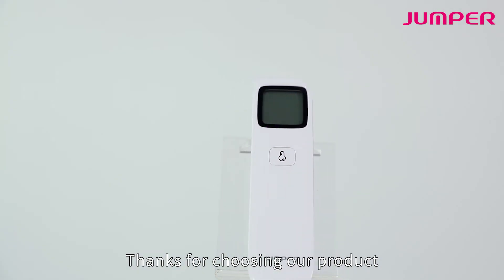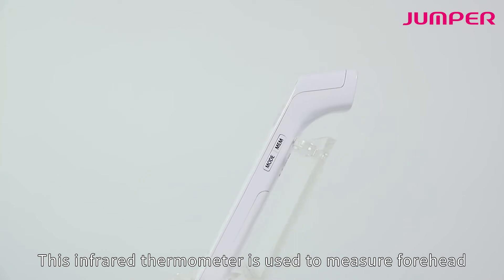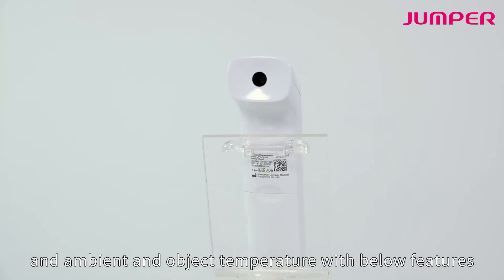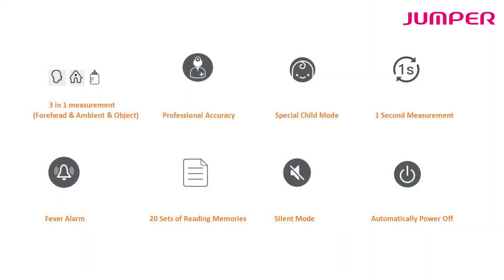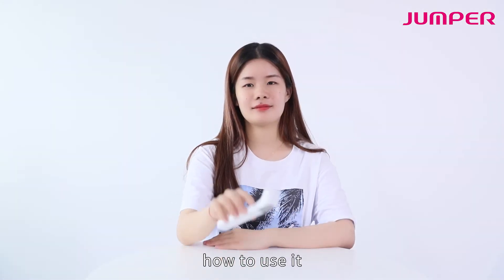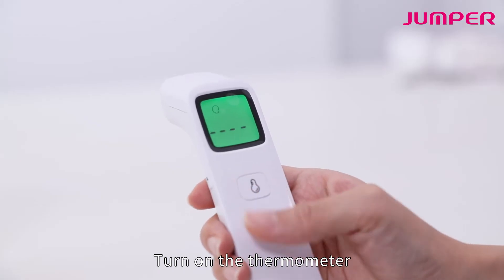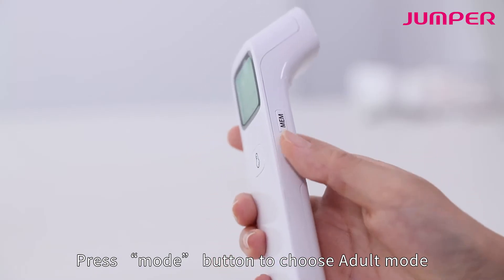Thanks for choosing our product. This infrared thermometer is used to measure forehead, ambient, and object temperature. To use it, turn on the thermometer. For forehead temperature, press the mode button to choose adult mode.